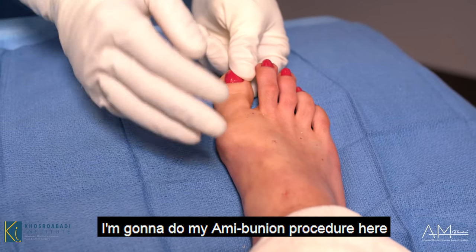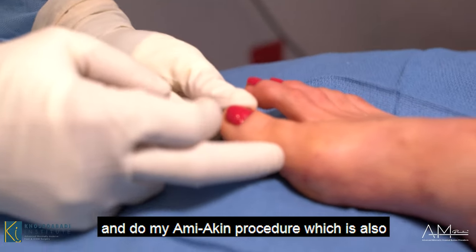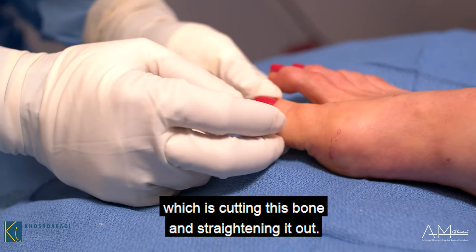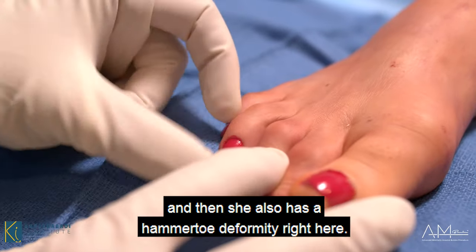I'm going to do my AMI bunion procedure here with three small incisions to correct her bunion, and then I'm going to do my AMI Akin procedure, which is also a minimally invasive Akin osteotomy — cutting this bone and straightening it out. So two bone cuts here.